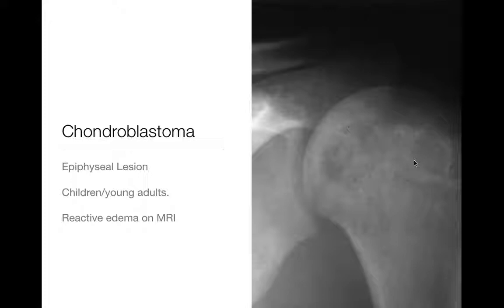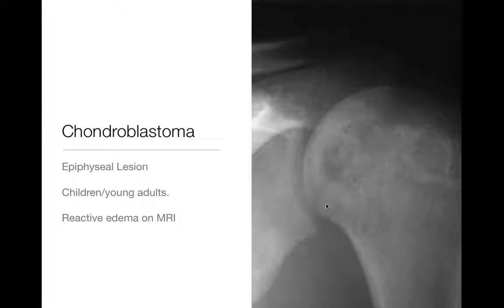The C is chondroblastoma — benign appearing lytic lesions occurring in the epiphysis. Here we have the proximal humerus with a geographic lytic lesion, narrow zone of transition, in the epiphysis. Typical location — should always be on your differential for epiphyseal lesions in a child or young adult. These don't occur in elderly adults, though there is a mimic in older adults: clear cell chondrosarcoma. On MRI they can have a lot of reactive edema around them. Epiphyseal lesion in a young adult — think chondroblastoma.